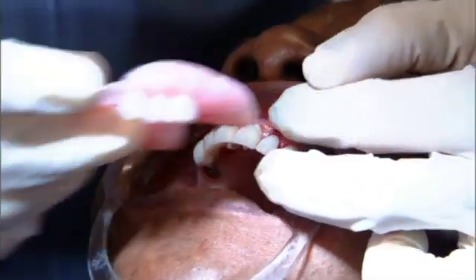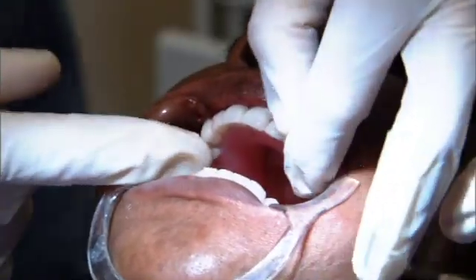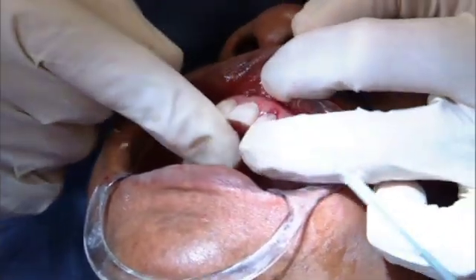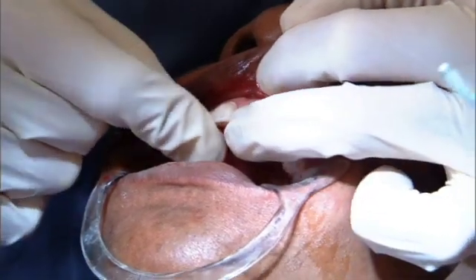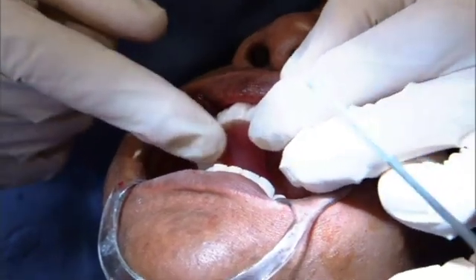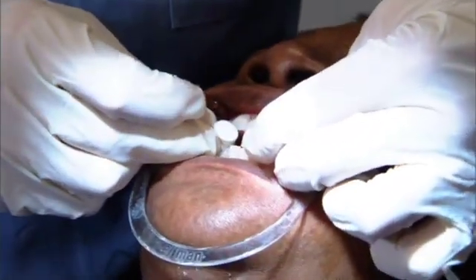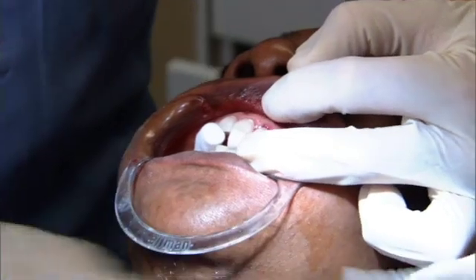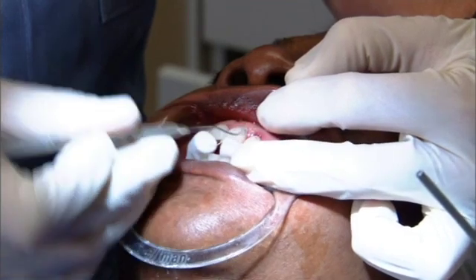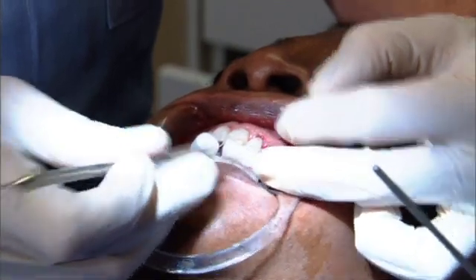This, frankly, is where the rubber meets the road. A little temporary partial just fits great. And while I'm holding this in place, why don't we just use 2 cotton rolls and let her kind of hold it in place. Bite together for me now, and just squeeze a little bit. While we're holding that in place, all I've got to do to trim this temporary is take an Explorer, trim up a little bit of excess that's there, not much.